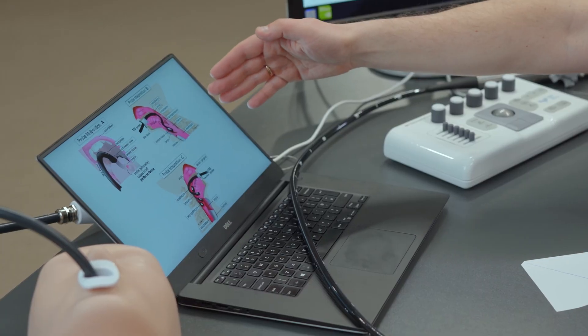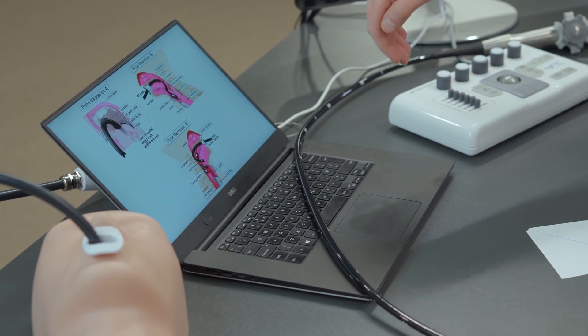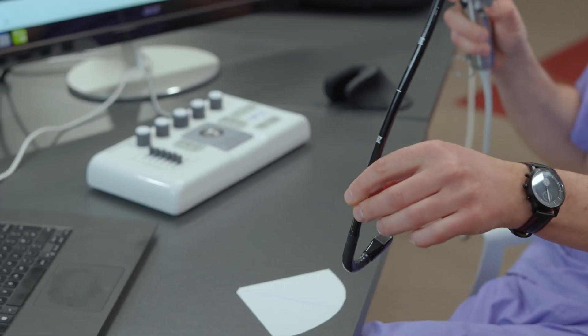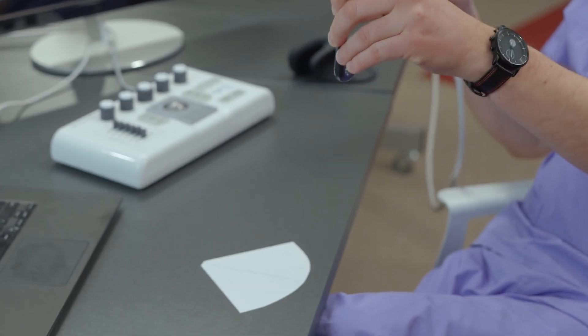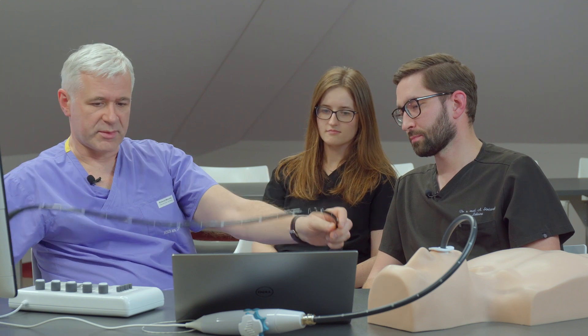Also, when you insert the probe, you may have trouble with the probe penetrating the wrong direction, as you can see here, or penetrating the larynx. So you have to lead the probe on the posterior wall of the pharynx to go directly to the esophagus. Whenever you see resistance, you should not force it, because you can damage something inside. It is even possible that you may create a loop in the esophagus — if you see how much the probe is bending during the examination, you can really make a loop that will hook and remain there. So you have to be very careful.